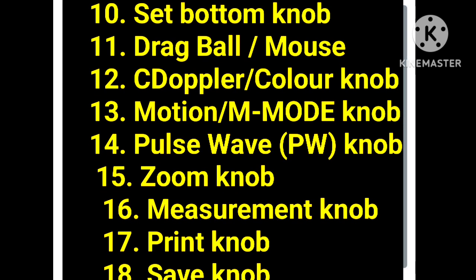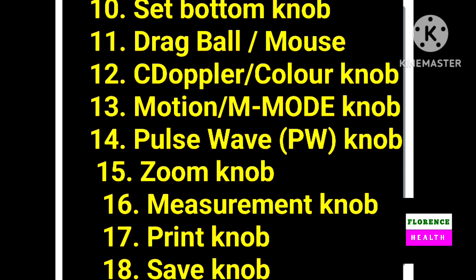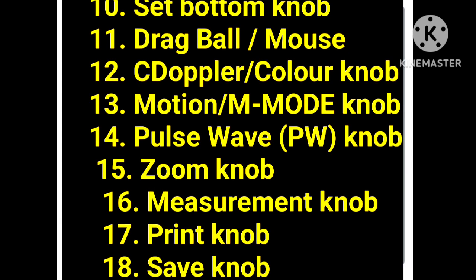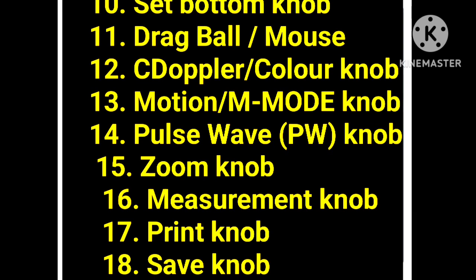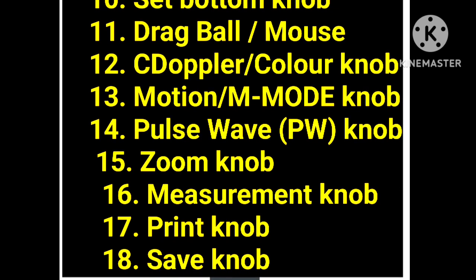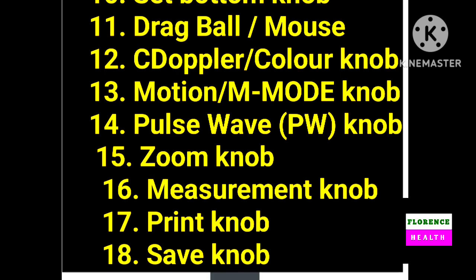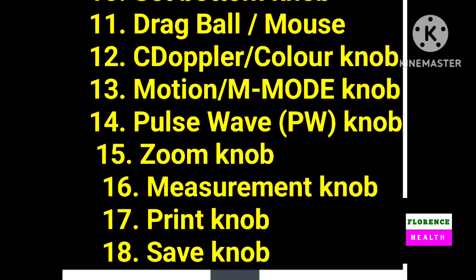By keeping multiple focal position and multiple focal number, less quality of image will be produced on the monitor. Remember, again I am telling, keep the focal position on the target area and keep focal number as minimum as possible.